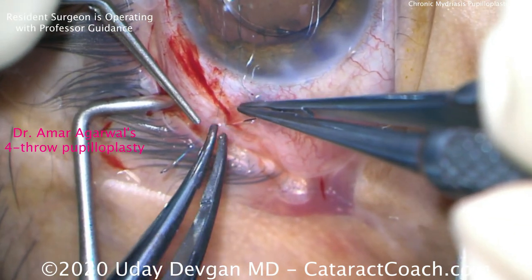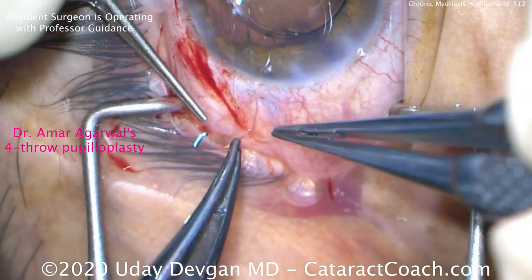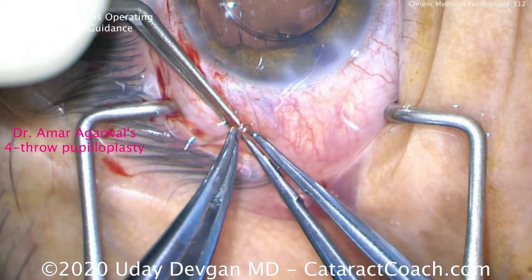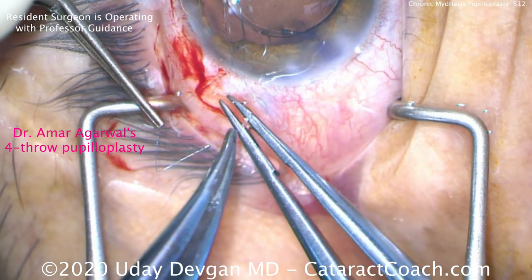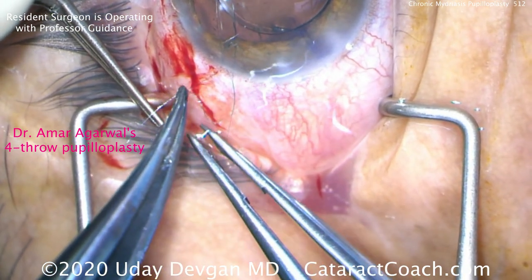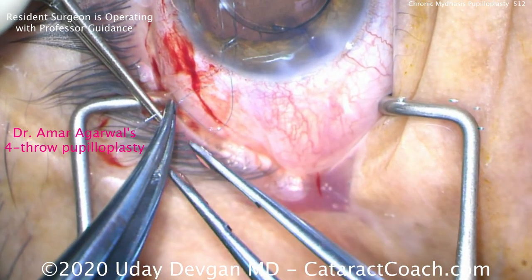This surgery is actually being done by a senior resident with professor guidance. So if a senior resident can do this technique, you can do it too. Again, this is Amar Agarwal's four-throw pupilloplasty — thank you, Amar, for a beautiful technique. We find it very useful.